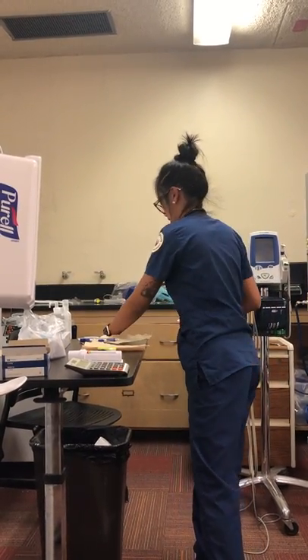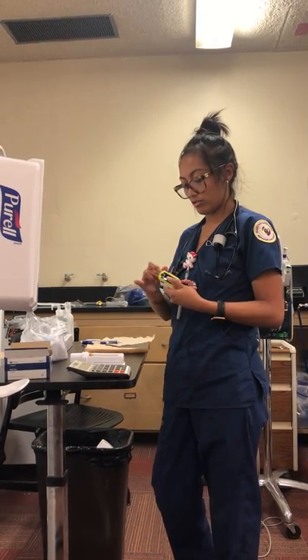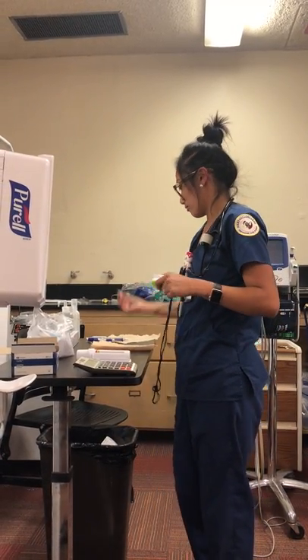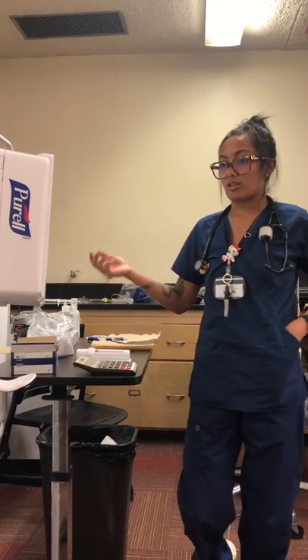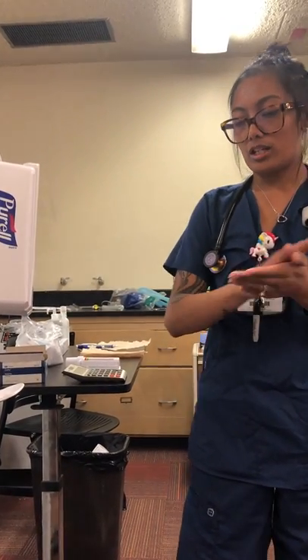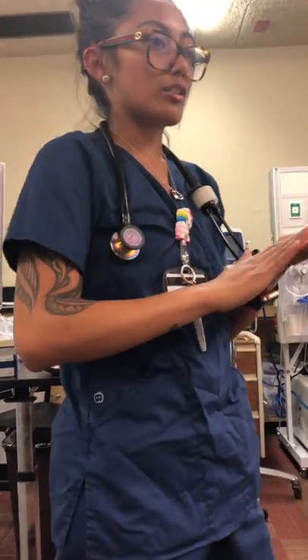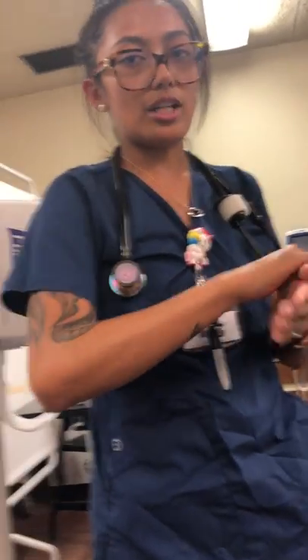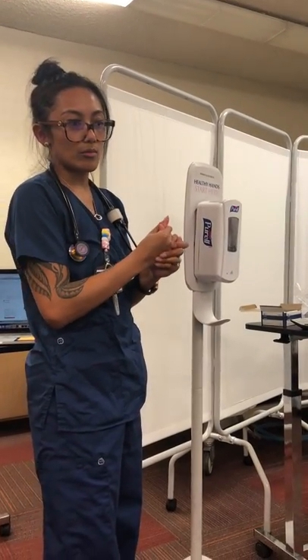Now I'm going to clean my pulse ox. I'm going to sanitize my hands again before entering into the patient's room. I also checked if there were any PPE requirements, and there are none needed for today. So I'm going to enter into my patient's room.